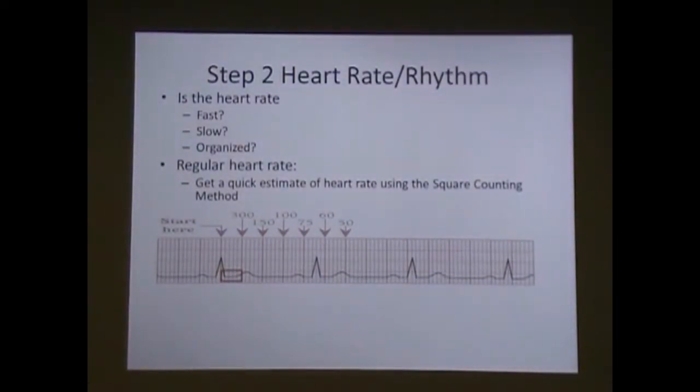The easiest and smartest way, and I don't know if your monitors do it, but every pleth is going to give you a heart rate off the pleth. So whenever I have a really high heart rate that it's reading because I'm quickly looking at it, I automatically go down to the pleth to see if it's correlating. Because this is electrical, your pleth is truly mechanical. So no matter what's going on here, your pleth is telling you what your mechanical is. And you can do a lot just off a pleth. If your EKG breaks, you can tell a lot from a pulse ox.